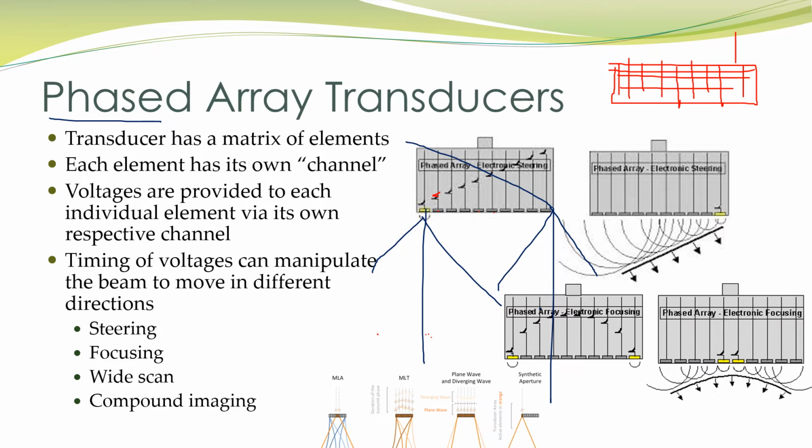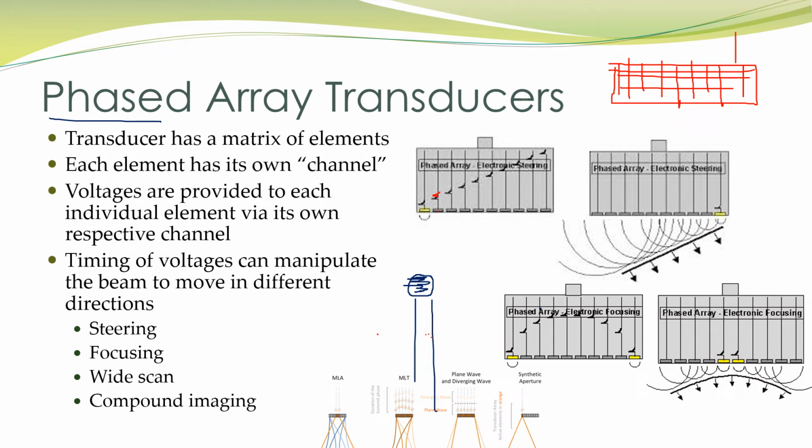Now, why this is important for you is one of the things that we can look for to give us clues about contents of an anatomic finding. For instance, a cyst is usually anechoic internally, and then it has what we call posterior enhancement, or a brightness behind it. And that's because there's less attenuation within that cyst. Now that's great. If I just have natural, normal, I'm focusing, but otherwise I'm just directing my beam straight down, I'm going to see this enhancement really well.